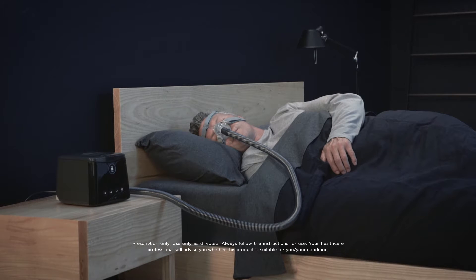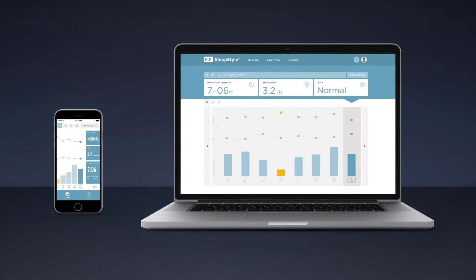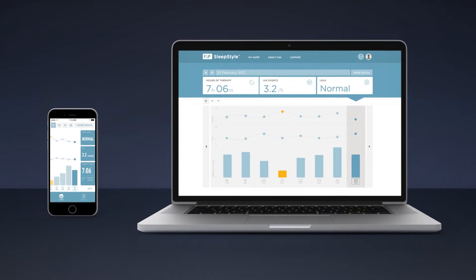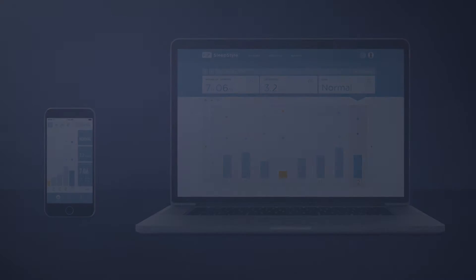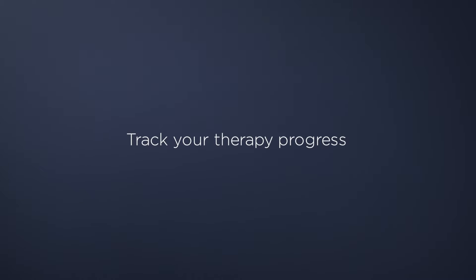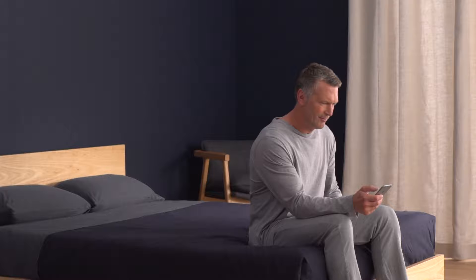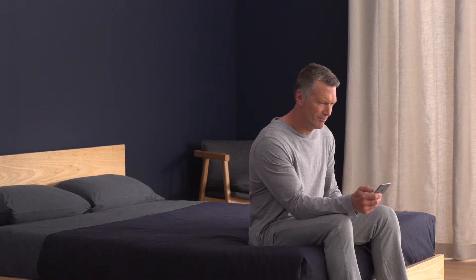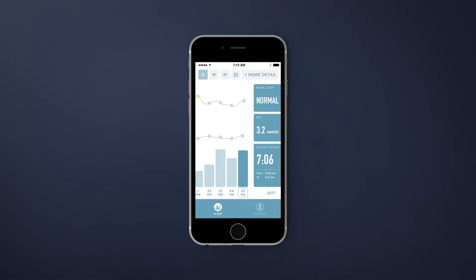Starting out on CPAP can seem complicated, but it doesn't have to be. We designed SleepStyle with you in mind to give you visibility into your sleep therapy. SleepStyle allows you to easily see your therapy data from last night and compare it to your therapy data from the night before.